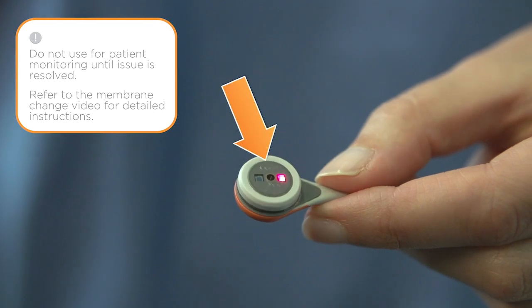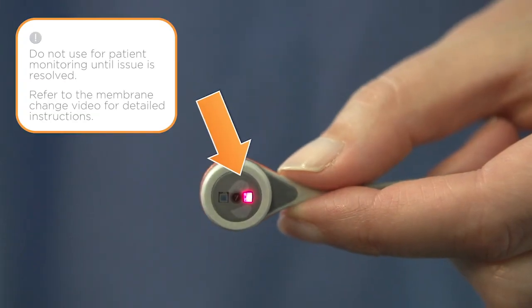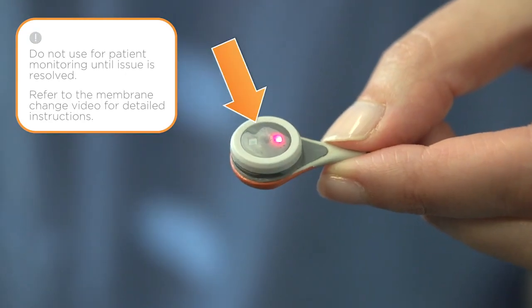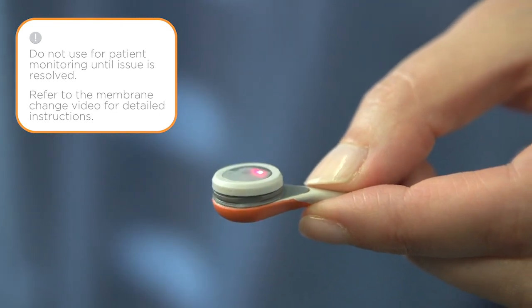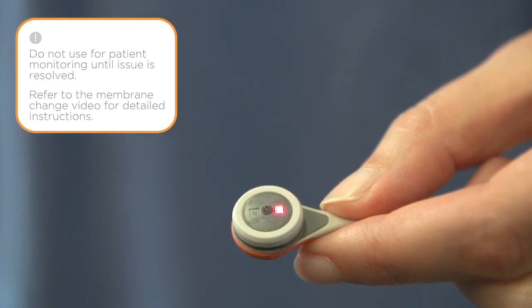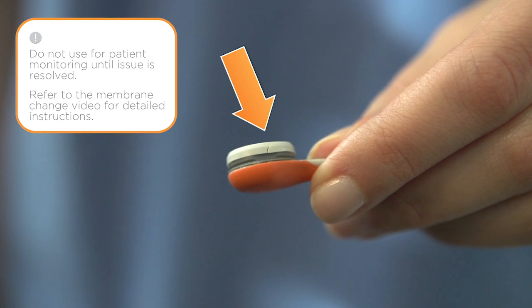If the membrane is wrinkled or torn, there are air bubbles present, the membrane has a loose fit, or the electrolyte is dried out, the membrane needs to be changed. The membrane must also be changed if there is any damage to the membrane ring.